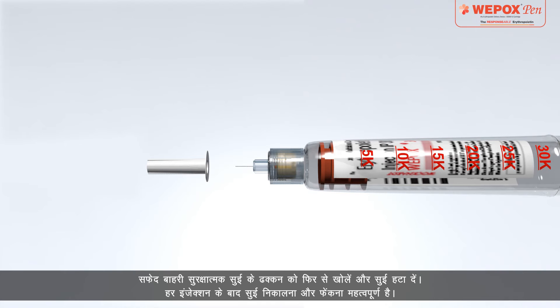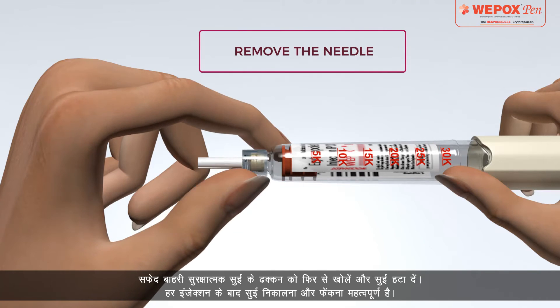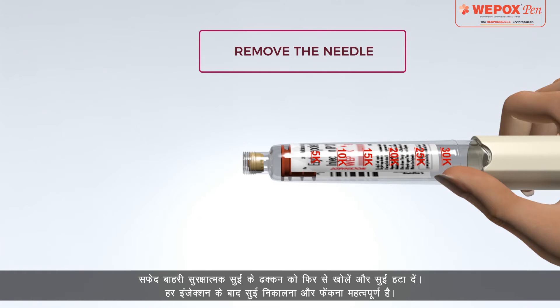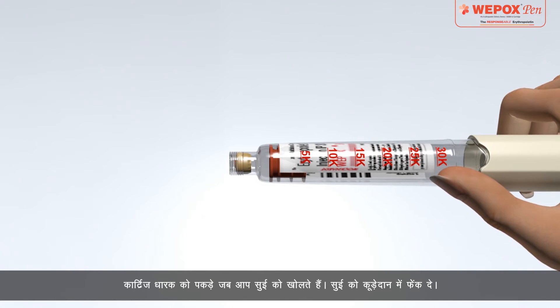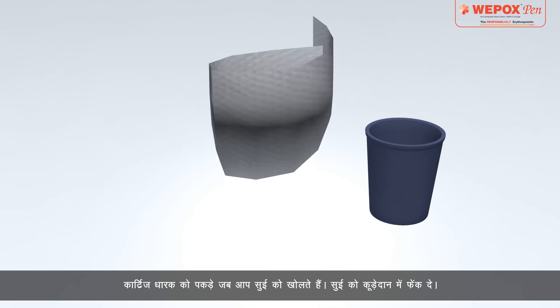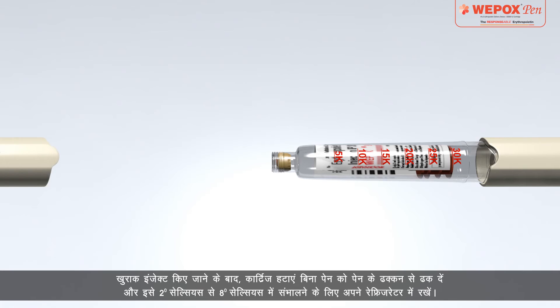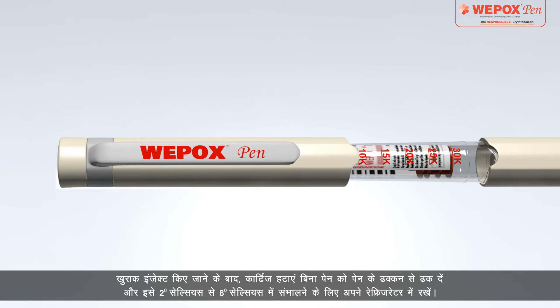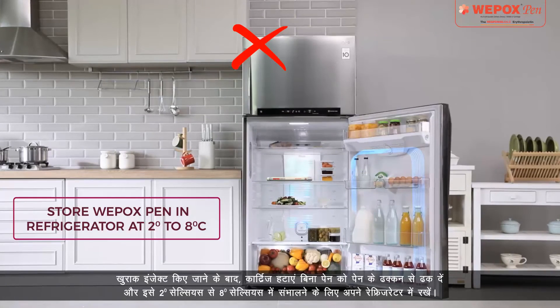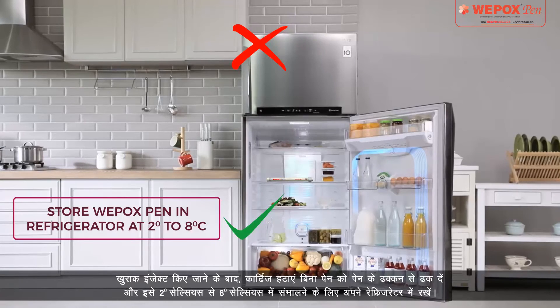Post Injection Instructions: Reattach the white outer protective needle cap and remove the needle. It is important to remove and discard the needle after every injection. Hold the cartridge holder when you unscrew the needle. Dispose of the needle in the dustbin. After the dose is injected, cover the pen with the pen cap without removing the cartridge and store it in your refrigerator between 2°C and 8°C.